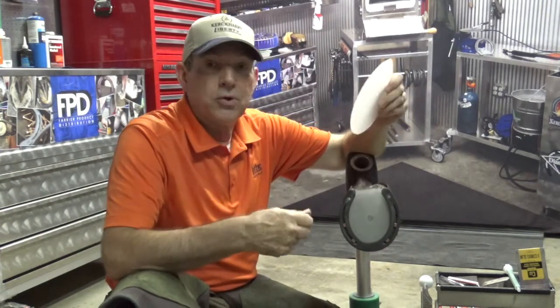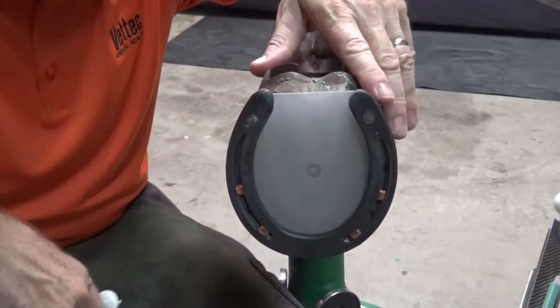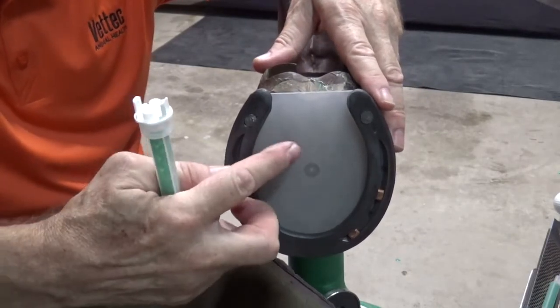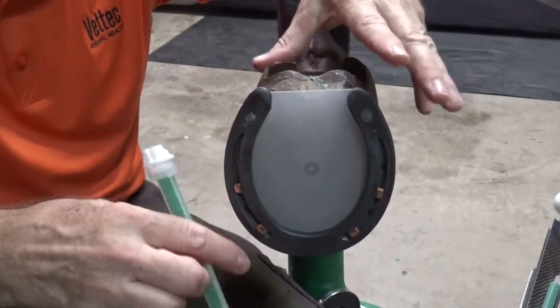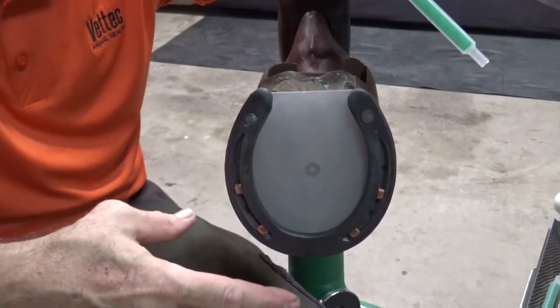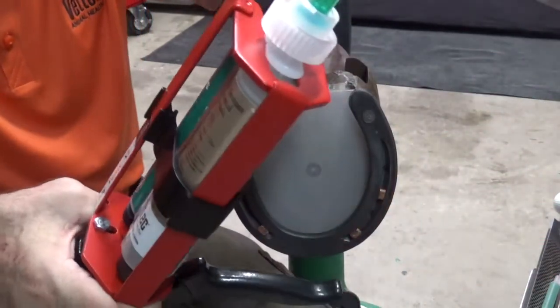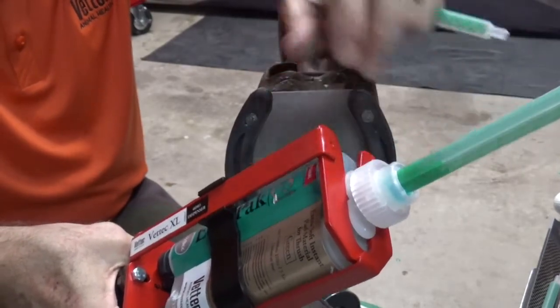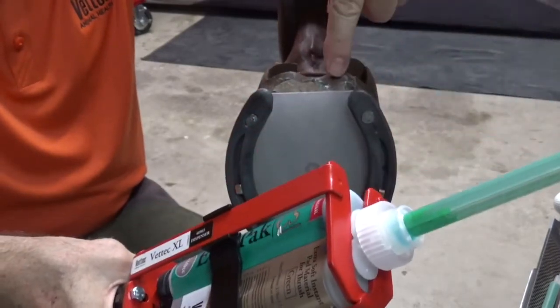So let's zoom in close and I'll show you a couple of ways to get around the square peg in the round hole problem. The first thing I'm going to show you will hopefully eliminate the need for the other two options. We know that on feet that are very flat, we're going to have to drill holes in the pad over the deepest parts of the foot and fill it that way, and that's still okay. But for the majority of situations, I'm going to show you that you really don't need to insert the mix tip under the pad at all, and you can still get complete fill and flow all the way to the toe. That's primarily because this new 210 cartridge system has dispensing ports that are so much larger, the material flows a lot better, and you can dispense it a lot quicker. That's really an advantage when you're trying to fill a pad just while holding the mixing tip at the heels.